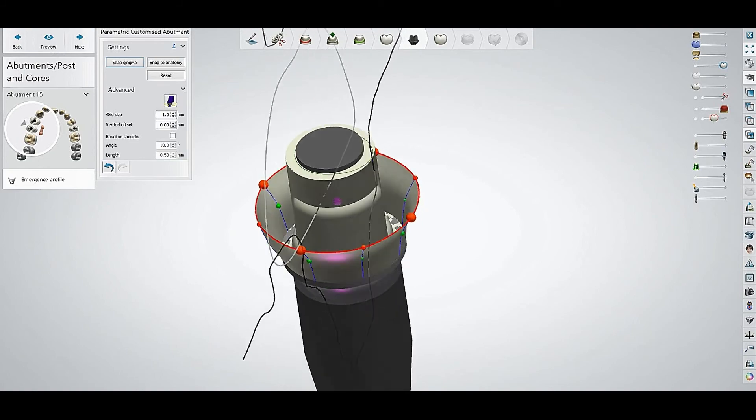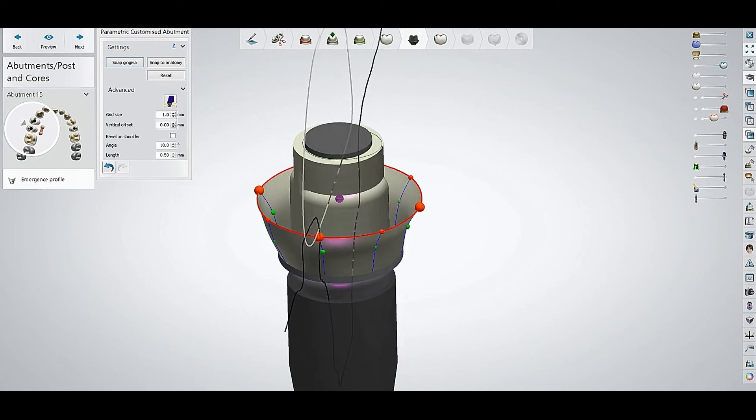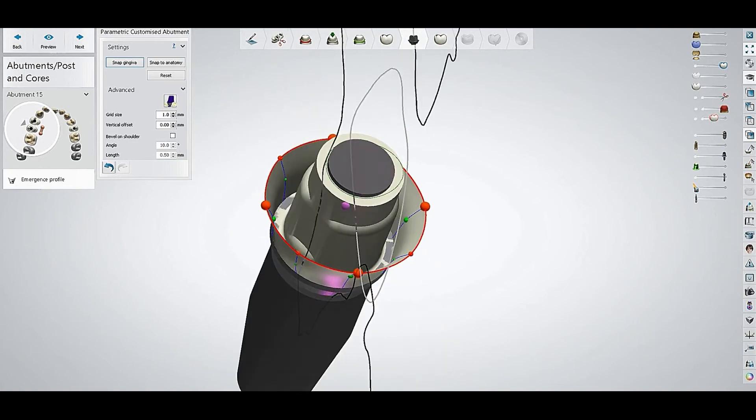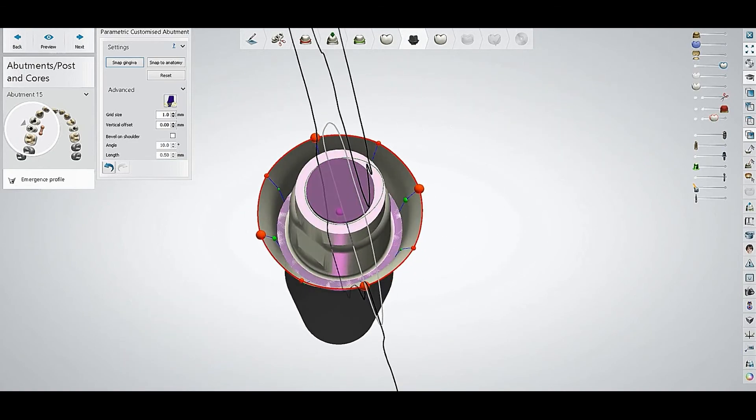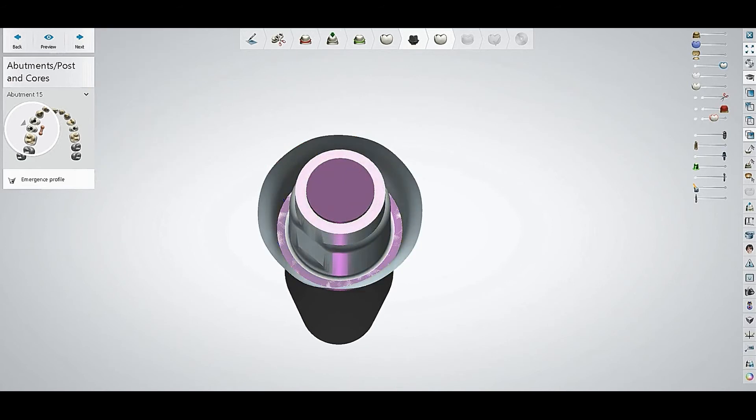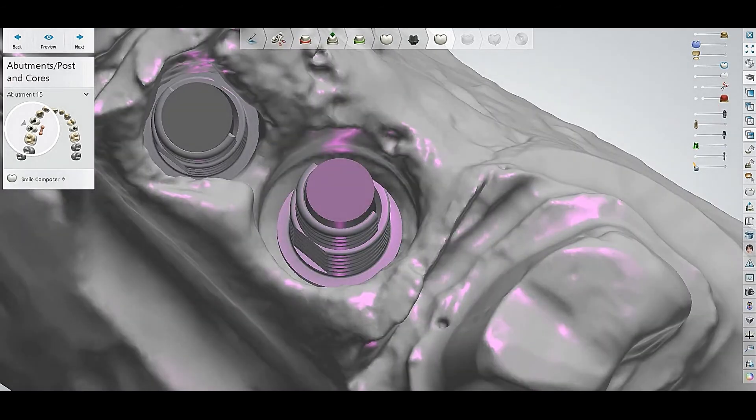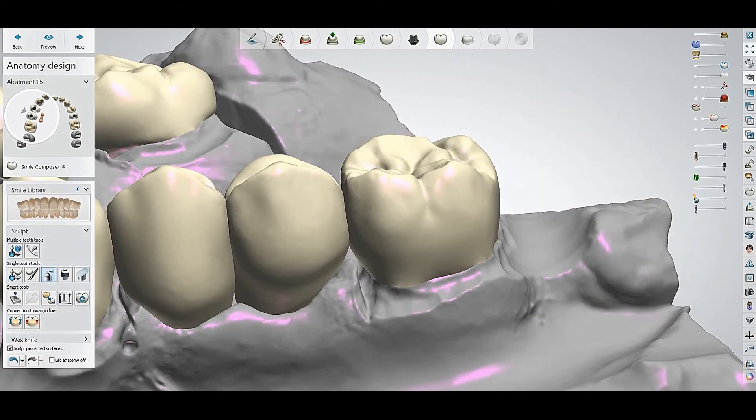Very easy, just control and left click. Then we will go back to the design and let's see what we will get.